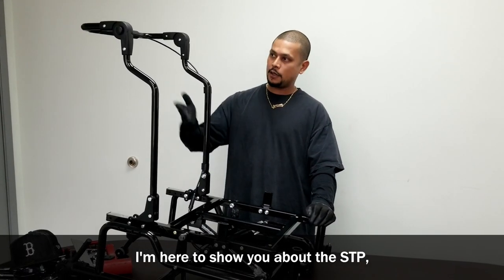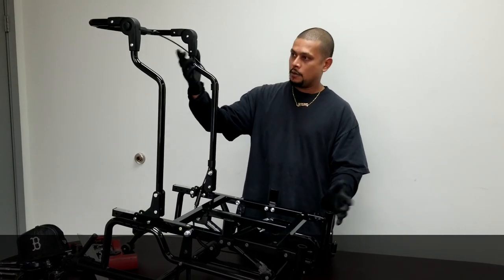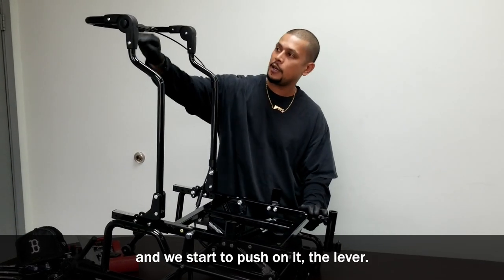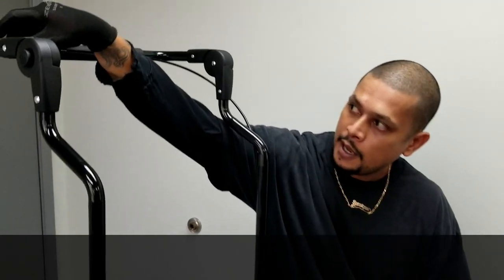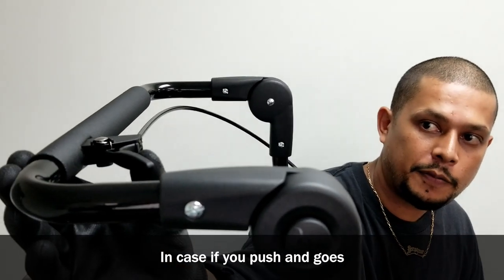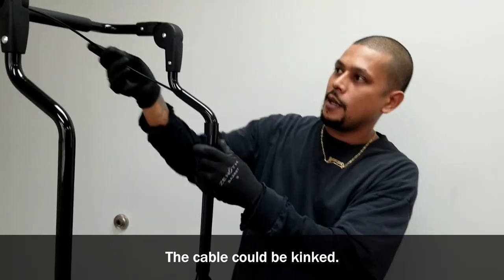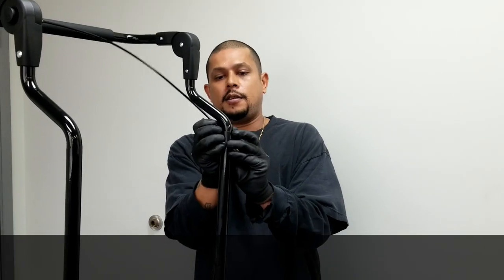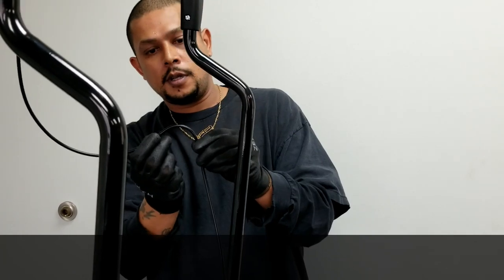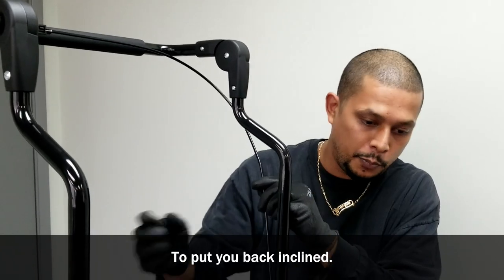I'm here to show you about the STP, and in case there's a problem with tilting or being stuck in a position, there are a couple of things you can check. First, go to the trigger, push on the lever, and see if it's going forward and coming all the way back. If you push and it goes back slowly or gets stuck, that means one or two things: the cable could be kinked, the clip could be off, or it could be pinched. These things will cause the trigger not to come back fast enough.